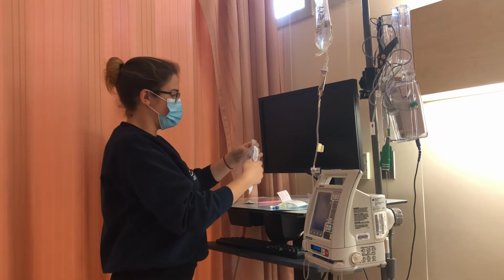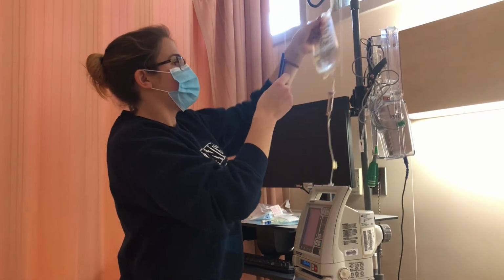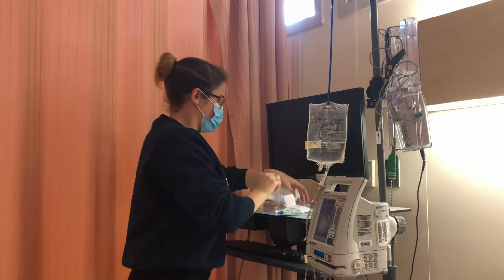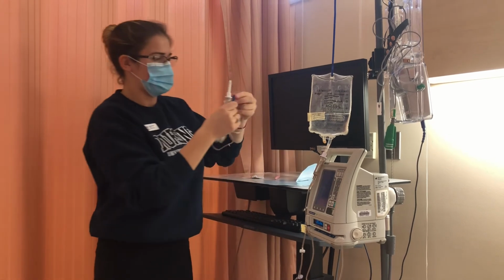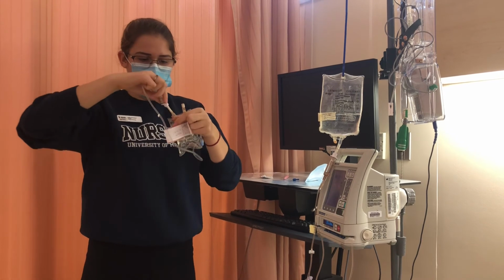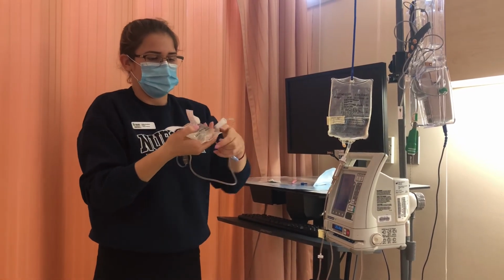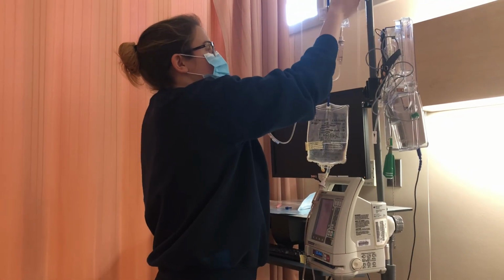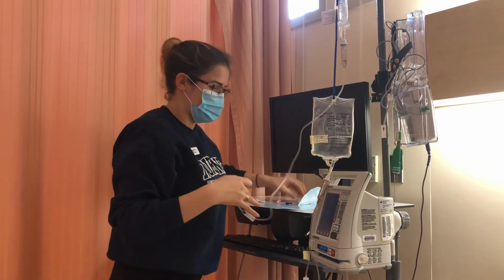So I'm going to first start by lowering my primary. And I'm going to make sure that I'm being sterile with my technique, alcohol swabs and my connect it. I'm just going to do my hand hygiene and enter the patient. So I'm just going to close my roller clamp to make sure that it won't forward slide, and I'm going to just put it up there temporarily so that I can attach it to my port.